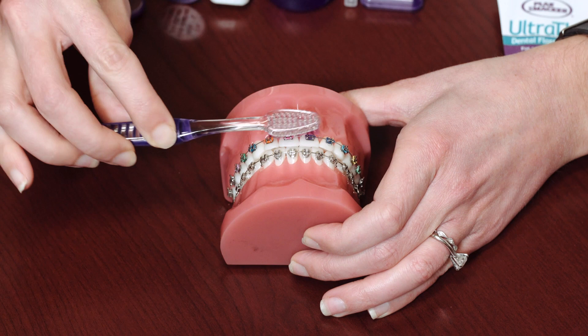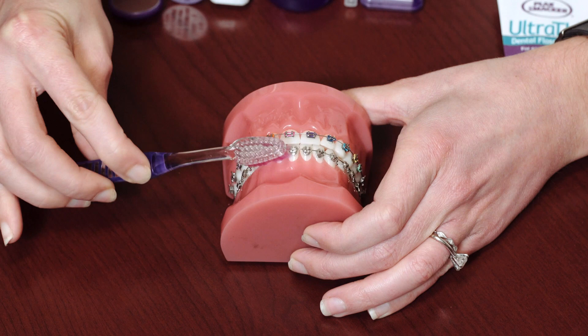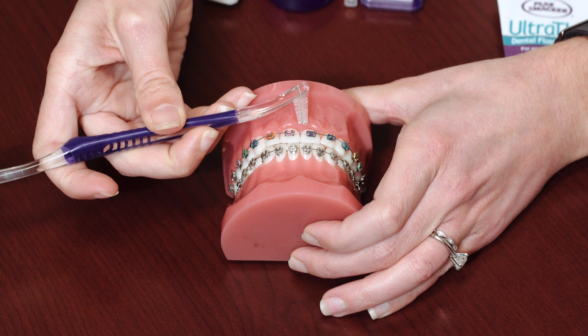It's important to go in circles rather than back and forth like a scrub brush technique, to prevent gingival recession. The top and bottom of the brackets are brushed as mentioned, and then the sides of the bracket are brushed with the proxy brush, which is inserted under the wire and moved up and down.